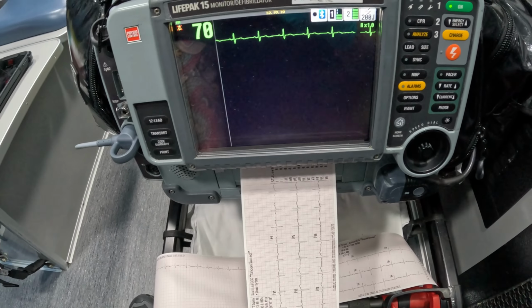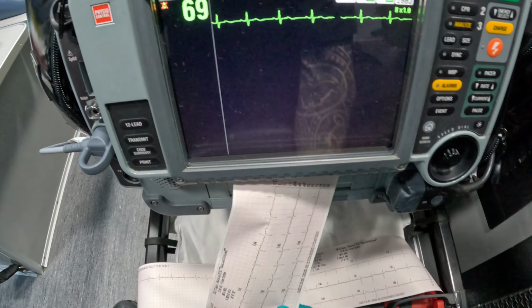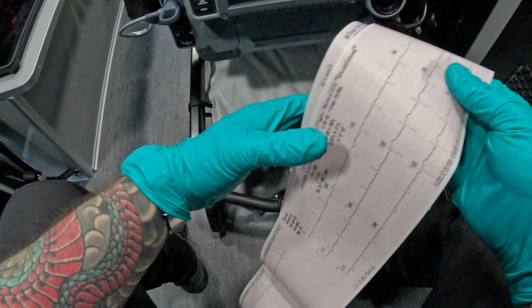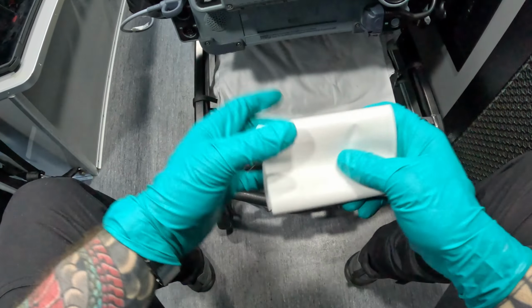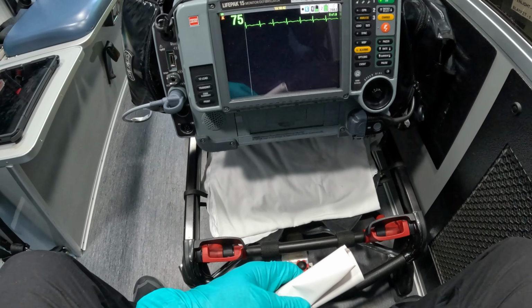So now we've got the 12 lead. Remember how I showed you, pull down, and then you've got your strips. You're going to present this to your paramedic and say, all right, we've got the baseline rhythm strip here, and the 12 lead here. And that's it. I usually leave the monitor connected at the bedside, and this will help your CC medic for these STEMI transfers or your cardiac transfers.